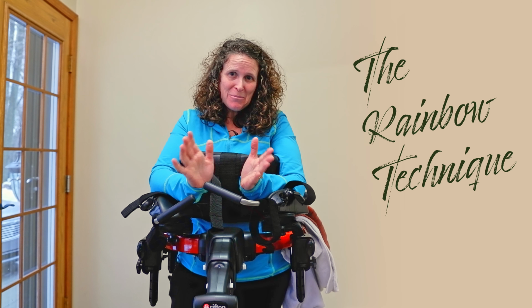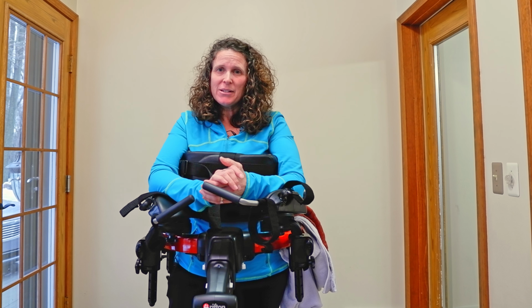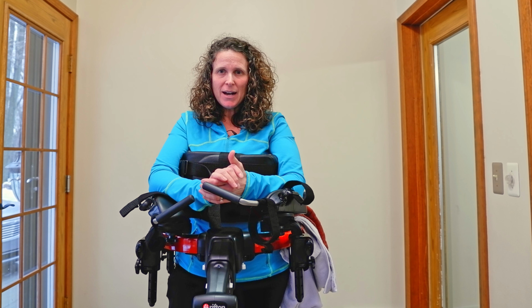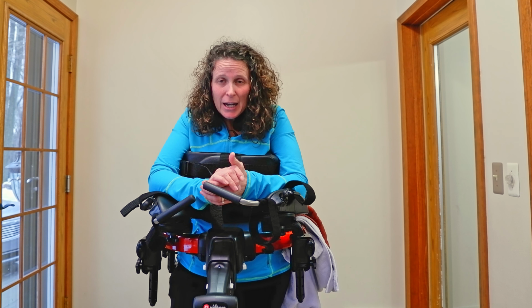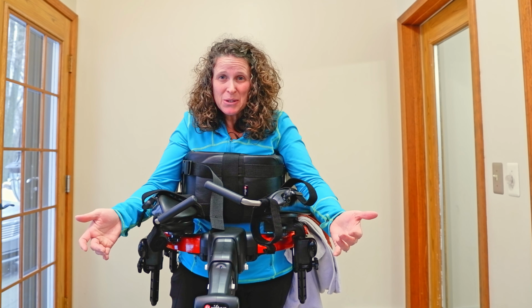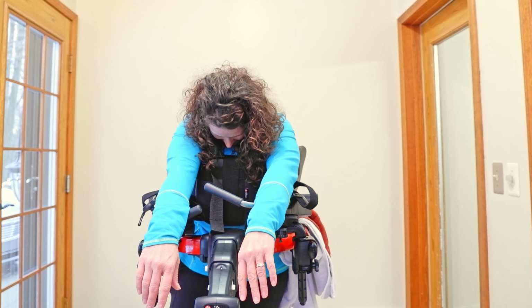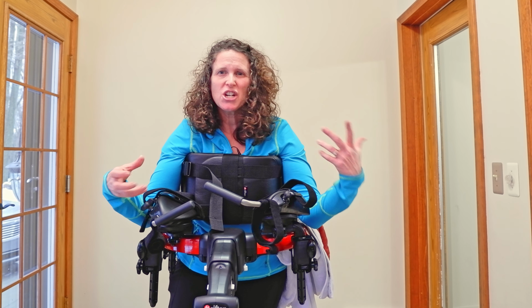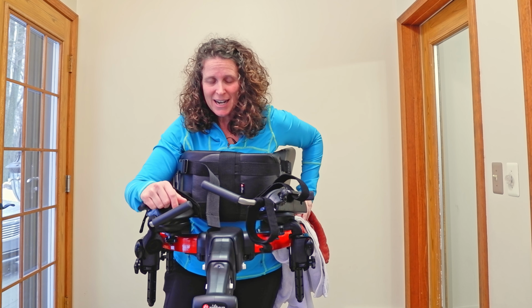And I don't know about you, but I do work with children that present with low tone. One of the things that I like to do when I'm with one of these kiddos is to provide a little bit of support for their chin. Typically when they are in the pacer, I would see this student with their head down. Sometimes their arms are not in a good position, hanging over their armrests and their head is down. Sometimes their arms are over here and they're still down, and you've tried to adjust it and it just isn't right. So I'm going to show you a little technique that I call the rainbow technique.